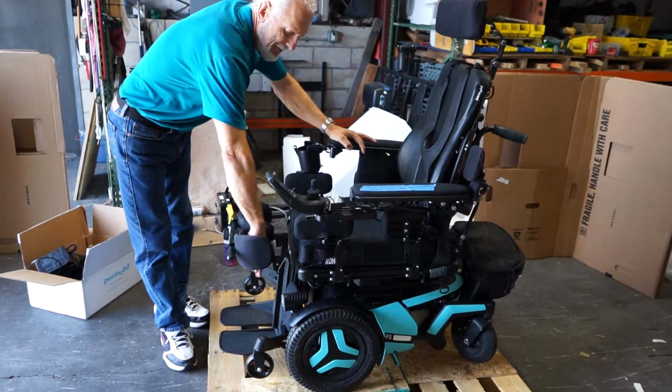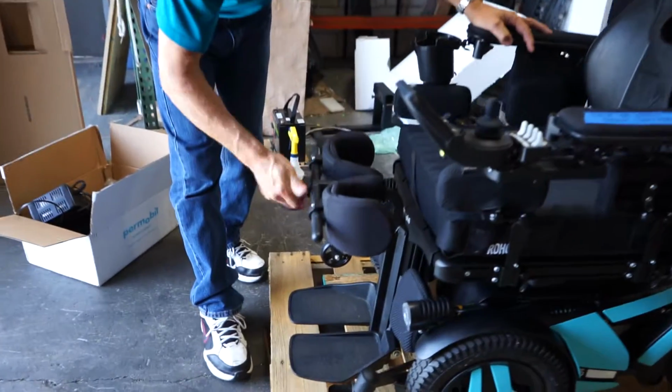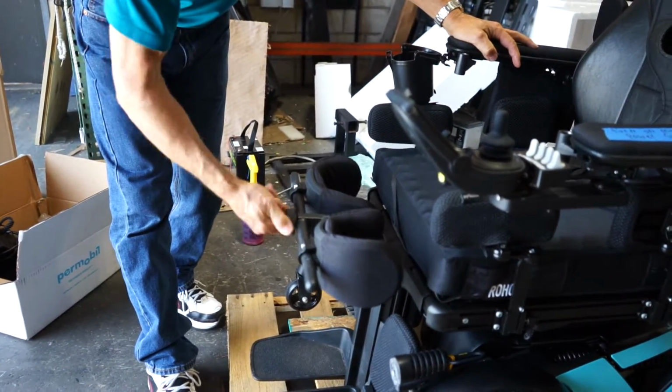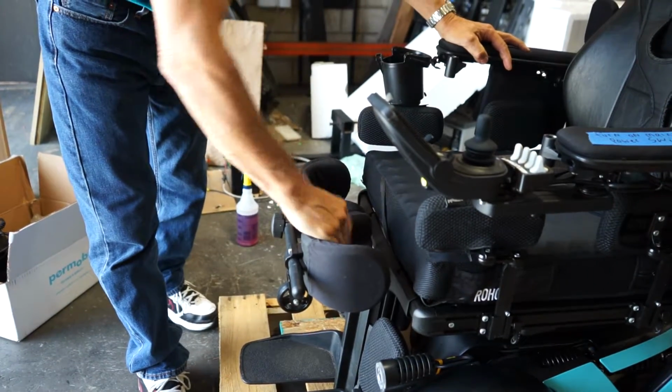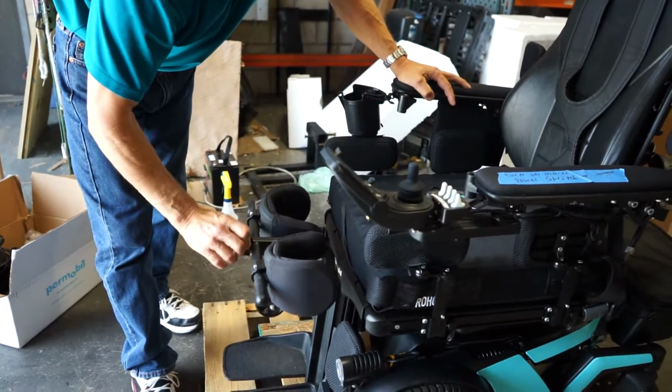If there's too much gap, when he's standing up, there's too much play in here, you can crank this way, and you can see it brings it into his feet, but you don't want to crush his feet. So this can be adjusted this way, right here, okay?